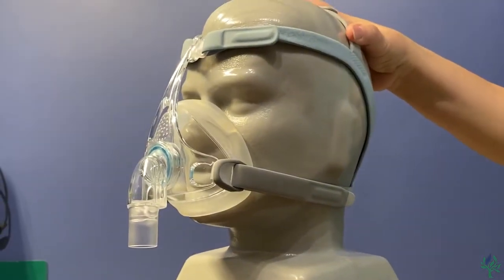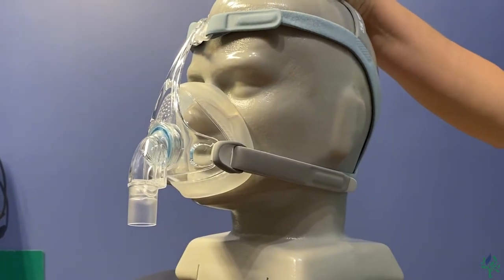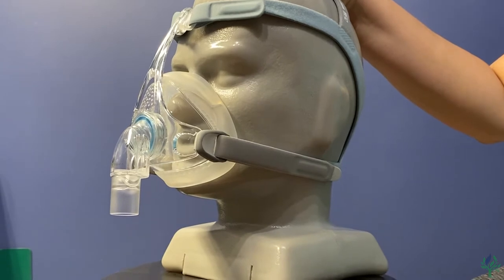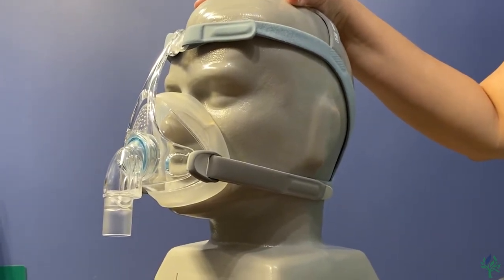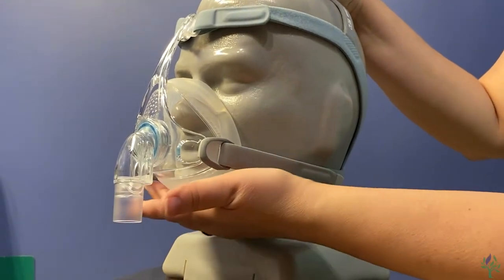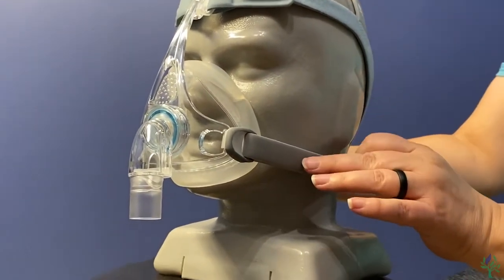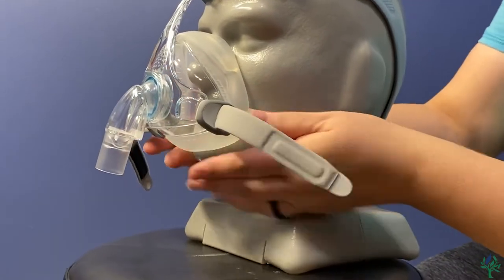Now the next thing that you want to do is go ahead and hook it up to the machine — whether that's a ResMed or a Philips — you'll go ahead and hook the tubing up here. Go ahead and turn the pressure on on the machine, and then you're going to look for any leaks that might be going on — any leaking down here, any leaking up top here. What you'll want to do is just go ahead and tighten these straps accordingly.